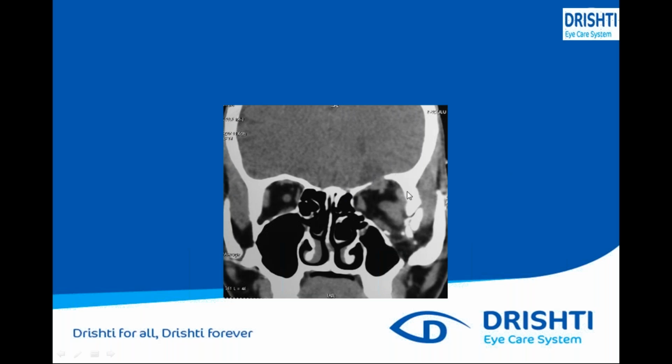This is the difference in how you need to see the reports of the patient. You always need to compare with the other normal eye. If both eyes are involved, you can compare in parts. Suppose in this area the frontal bone has been damaged, then this area is normal. In that case, you should compare with the other normal parts of the body. So the fracture is easily visible.